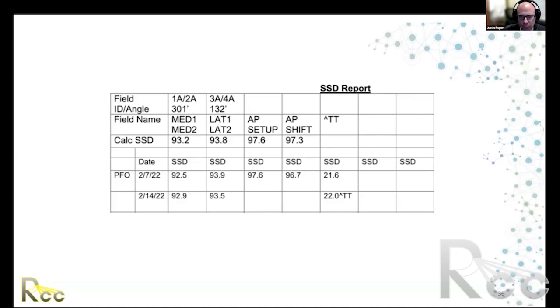It is also important to share any shifts between how the patient was zeroed or marked at the time of CT simulation relative to where the isocenter is of the treatment fields.